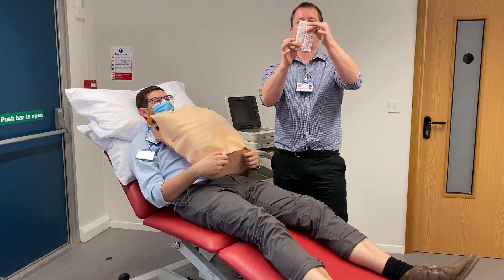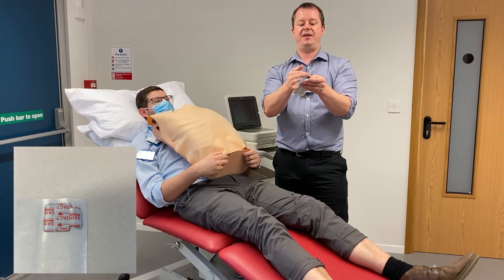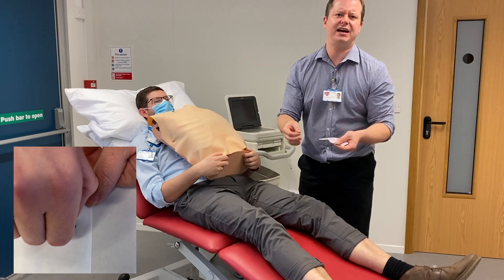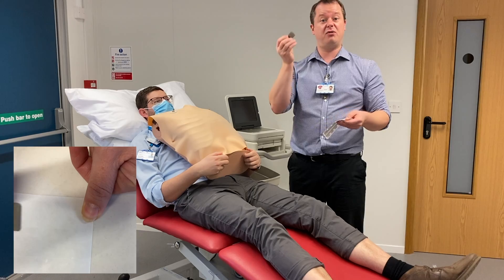When you do any ECG you will need 10 self-adhesive stickers. These ones that we've got here have a little tab on the side where the ECG machine will attach to. There are all sorts of variants out there - some have little poppers, some have little grips - but the ones we use here are the crocodile clip version, where we've got the tabs sticking outside.